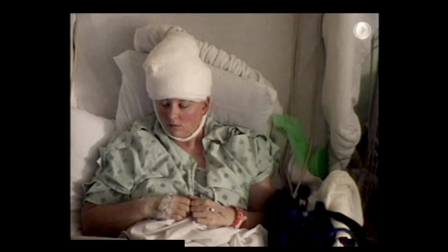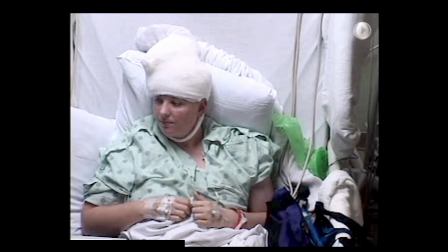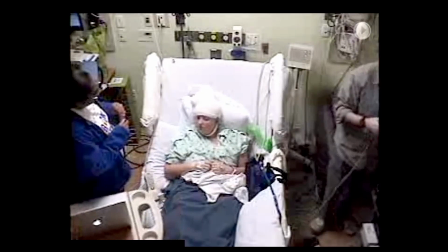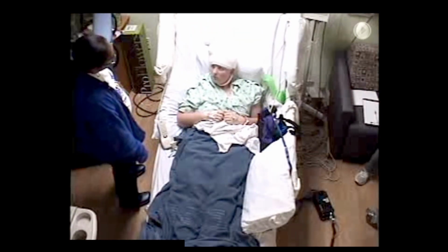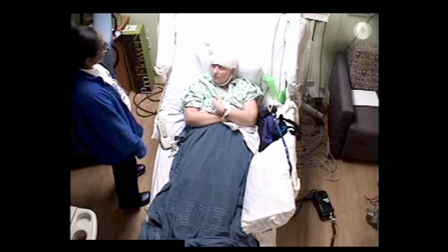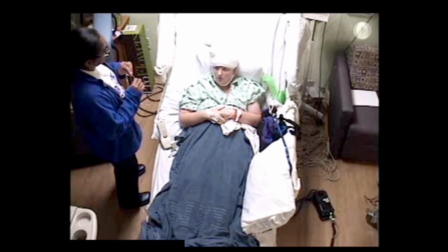Unable to speak. You have an answer? Is there any swallowing motion? Oh. What is this? Approximately 1 minute. Can you hold two hands for me? Put your arms up for me. Both arms. Tell me. Can you tell me your name? No. What is this? What is this?